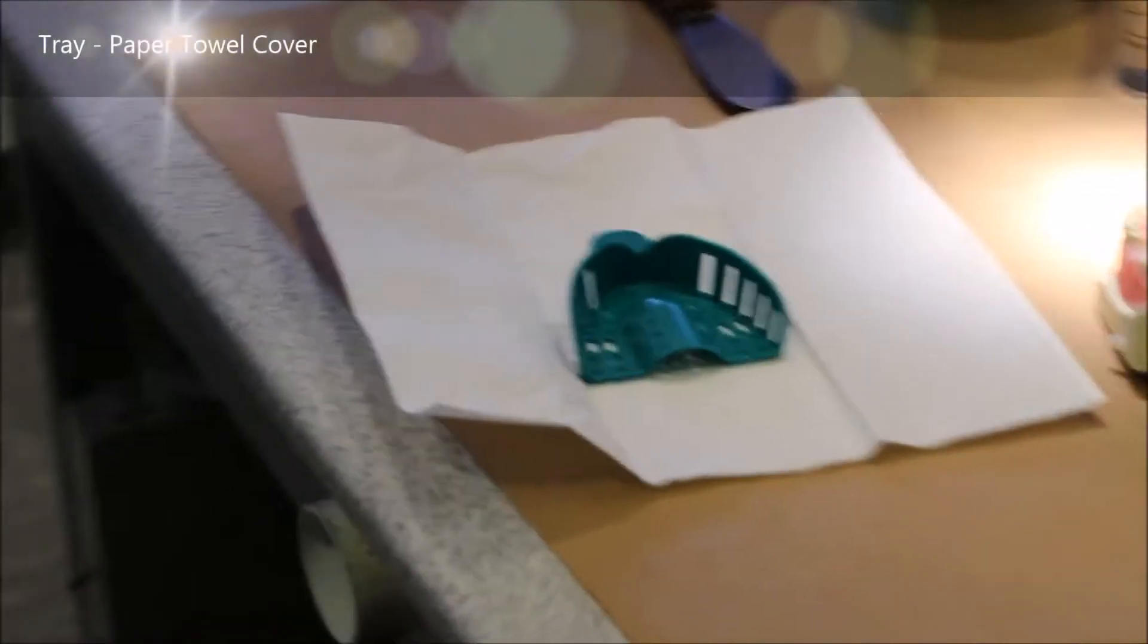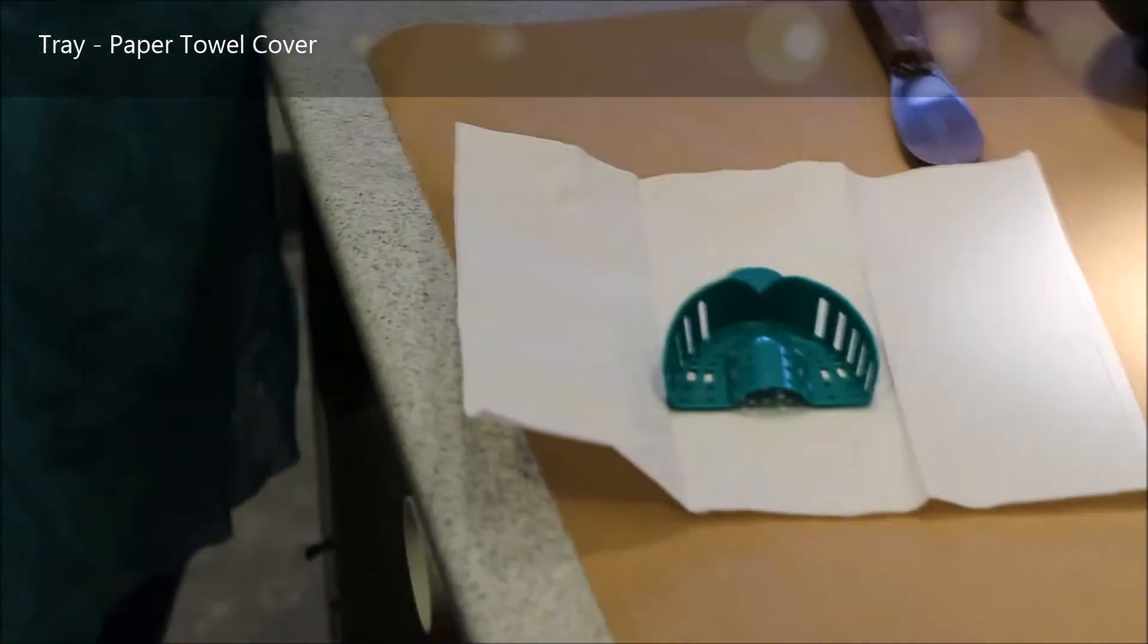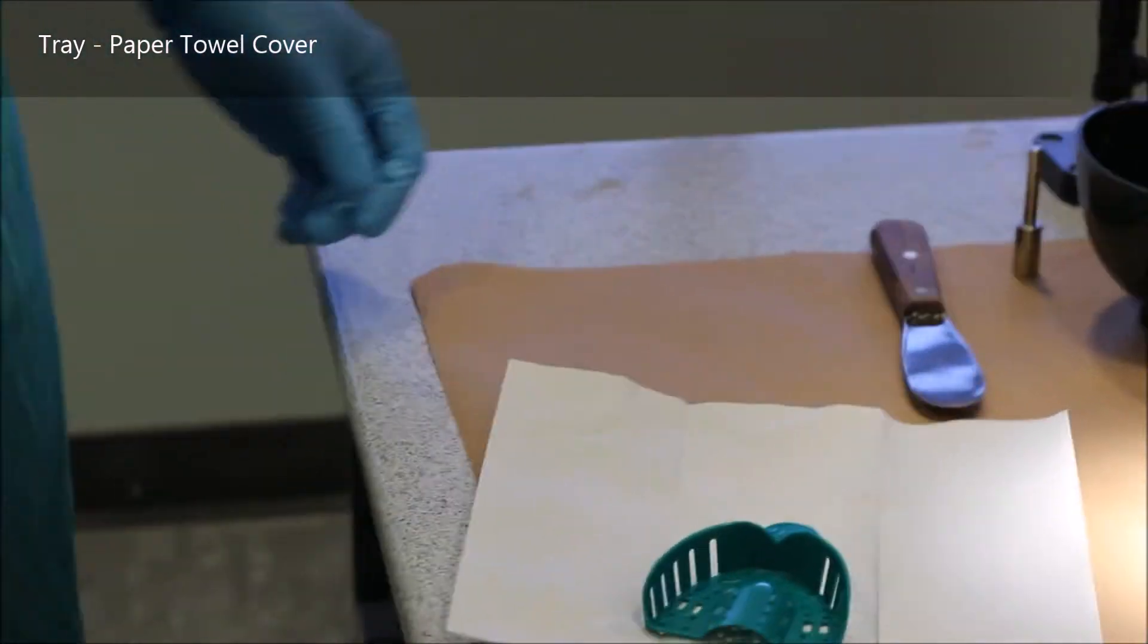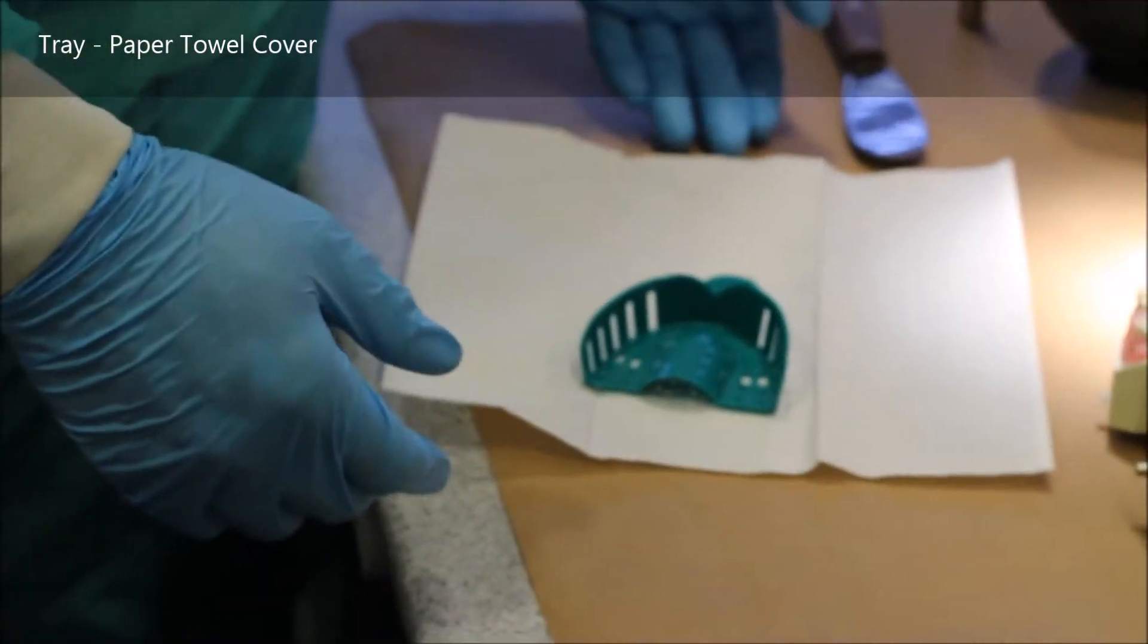In order to take an alginate impression, you will need a tray, a paper towel, some adhesive, alginate, a spatula, and a mixing bowl with pre-measured water.